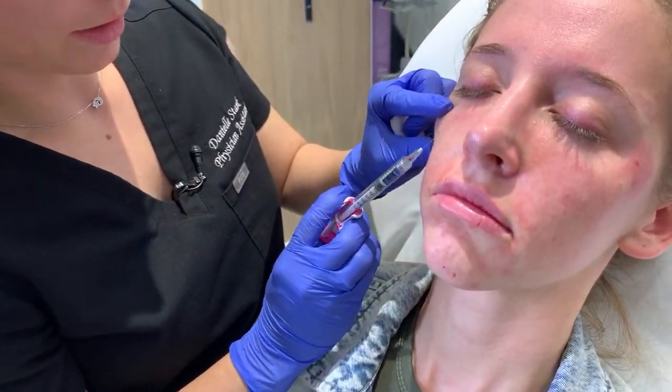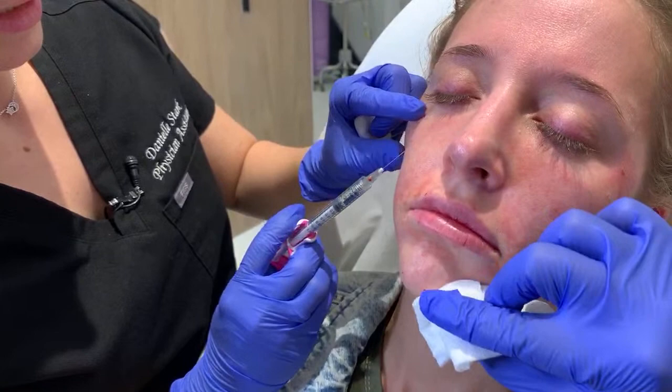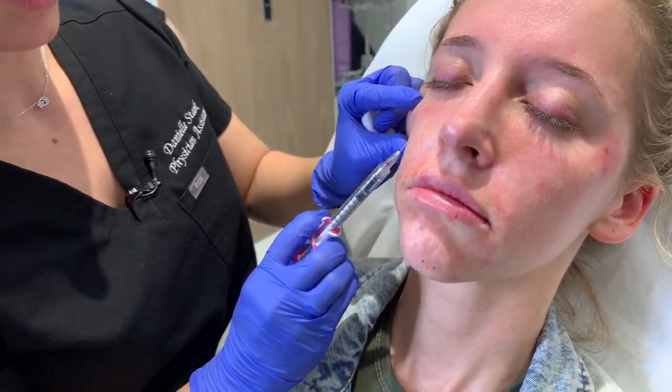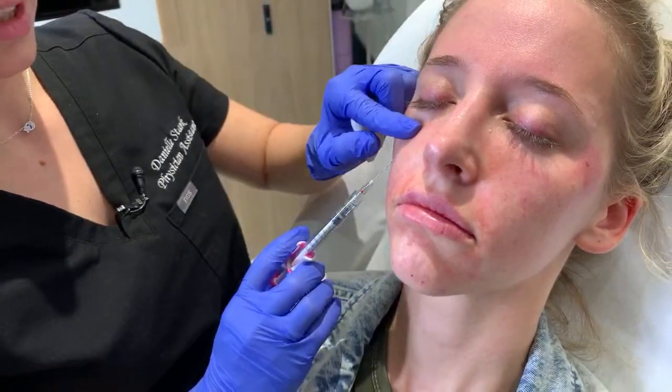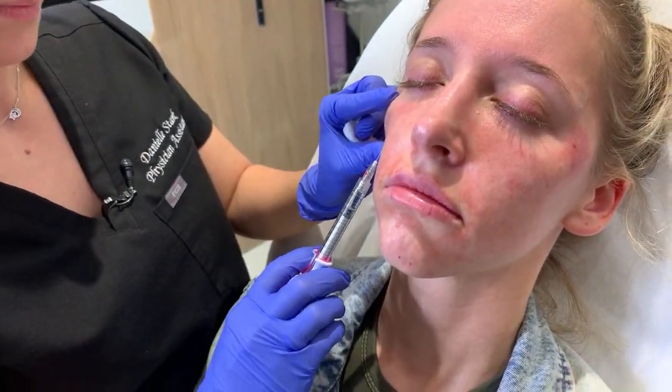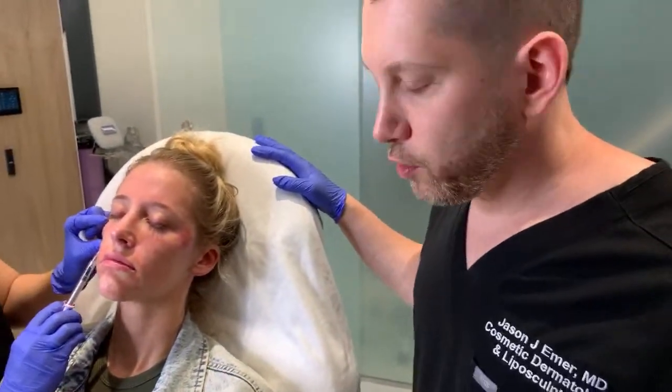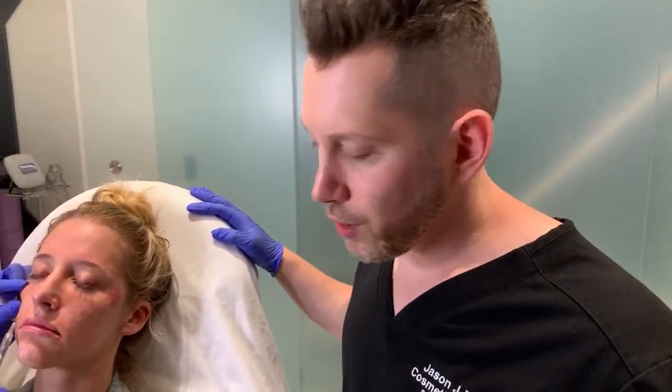For under eyes, especially someone where we filled in the hollow and now we just want to fine tune the small little ridges, it just needs to be soft. Here's the key, you guys, and I'm gonna be honest. If you look at the clinical data, Vycross technology fillers have the tendency to inflame sometimes a little bit later. So the key is you do small amounts, and I like it better because then you can see it and build over time, and it looks really good for a longer period of time.